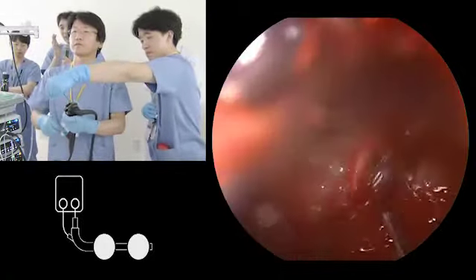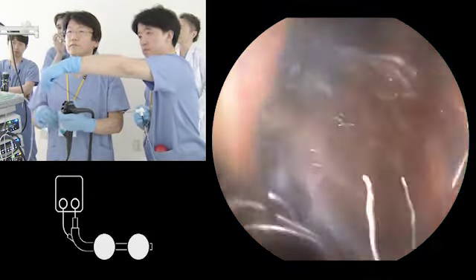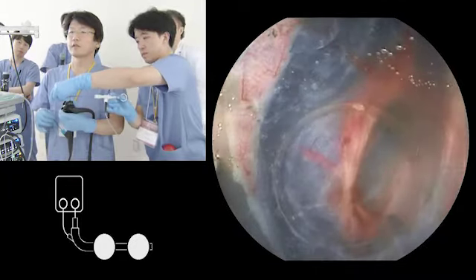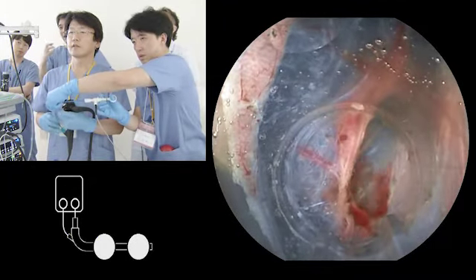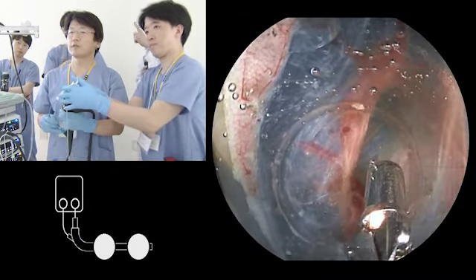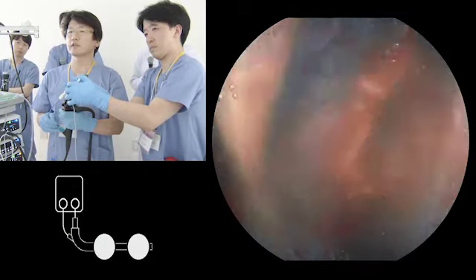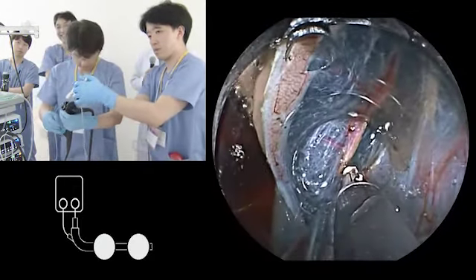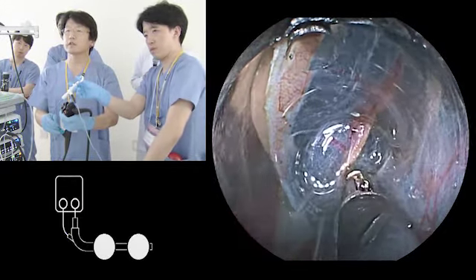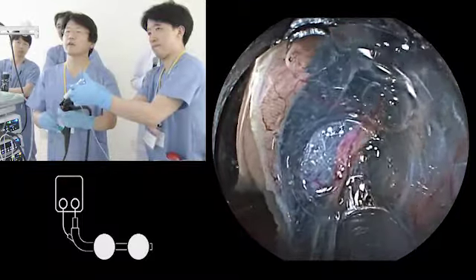So this kind of precise procedure is possible when we use the short ST hood. In case of the wider hood, it is very difficult to open. This is not the short ST hood. This is the conventional ST hood. I'm sorry. Did you change it? Yes. Good. Okay, and then I coagulate the blood vessel.